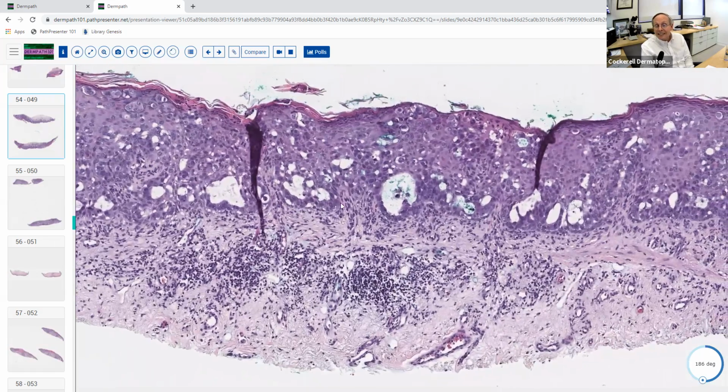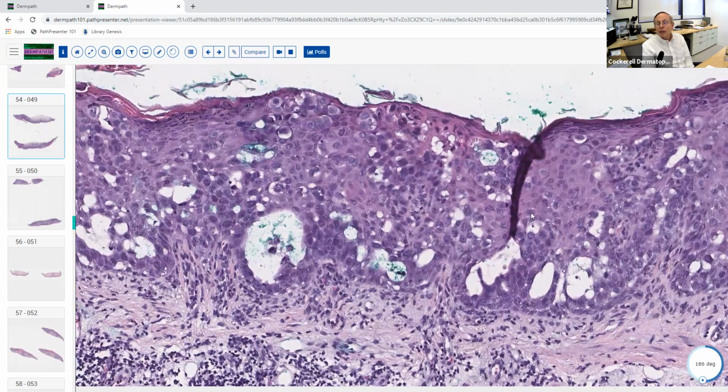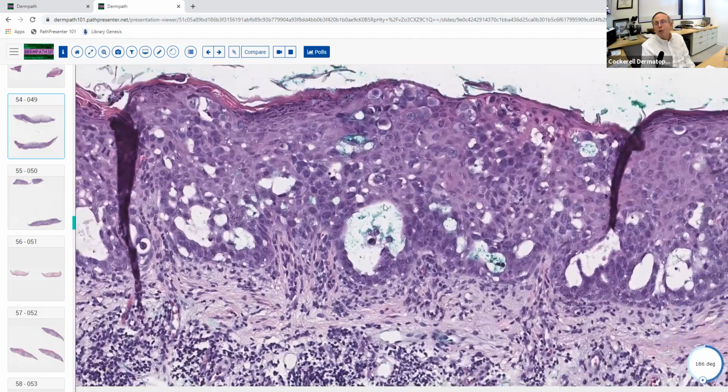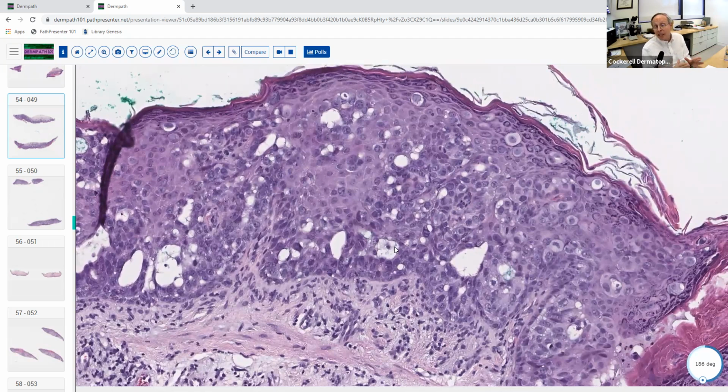And let's go to higher magnification. There's a reason that there are holes in the epidermis, especially if you get to this power. You can see that there are these large cells that have abundant cytoplasm. And then you look here, it almost looks like there are glands in the epidermis. Now, boy, that's not normal, is it? Glandular epithelium inside your epidermis, something bad is going on here. And notice how atypical these cells are all the way through the epithelium here, but sparing just the basal cell layer. A little teensy tiny area in the basal cell layer tends to be spared in this condition, like right here. Okay, so this is actually an intraepidermal neoplasm, and it's an intraepidermal metastatic neoplasm in this case, most likely.